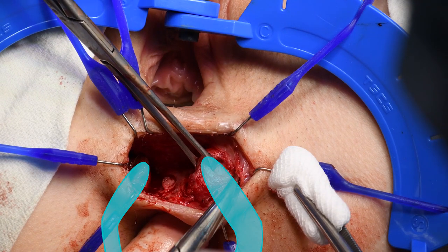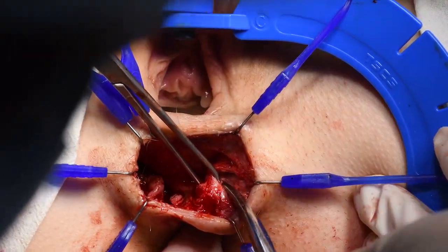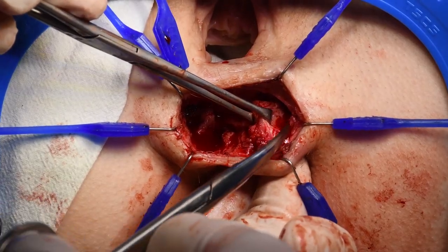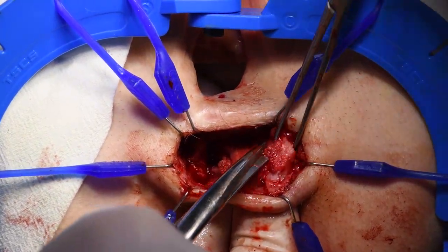Every sphincter edge is mobilized en bloc without separate identification of internal and external sphincters. Fibrotic tissue should not be excised. Full length mobilization of the sphincter's fibrotic ends is performed up to the levator muscle if needed.